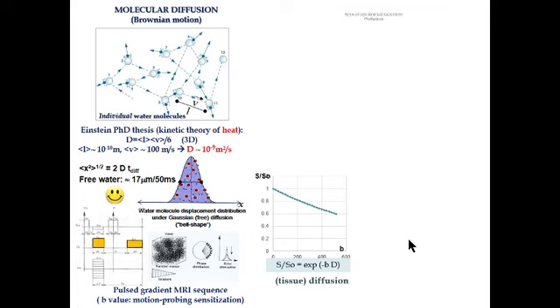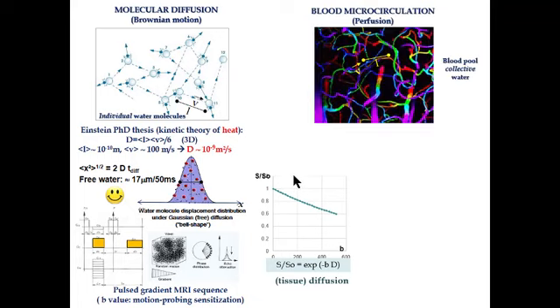This is diffusion MRI. Now look at blood microcirculation. Again, we are not looking at single molecules. We are looking at a pool, a bolus if you like, of water flowing in the bloodstream inside the vessels. Again, we can identify the mean capillary length, the segments where capillaries are straight, and the mean velocity.